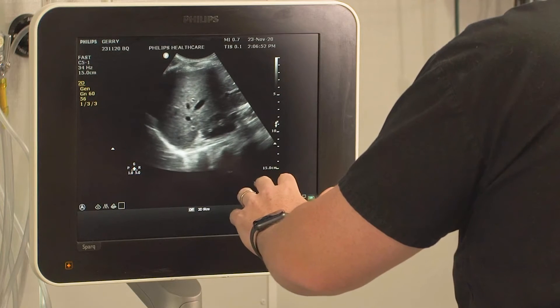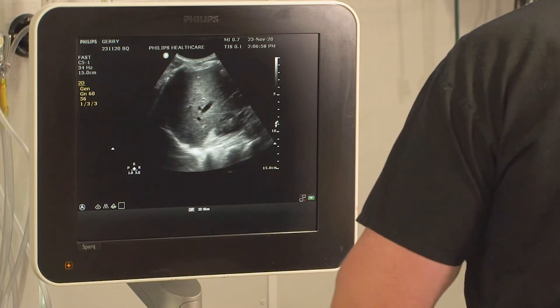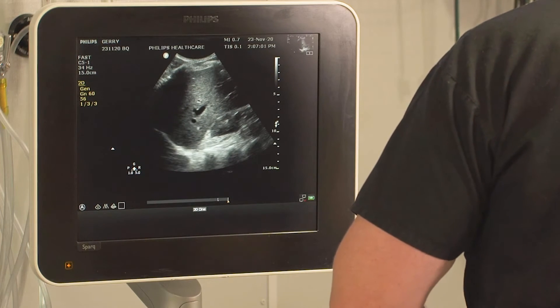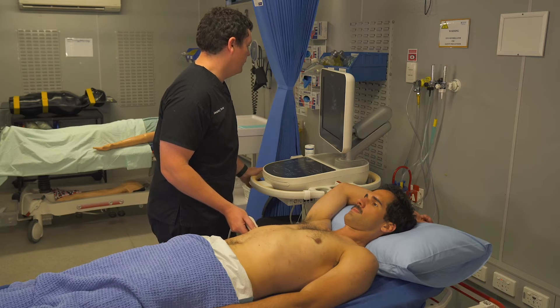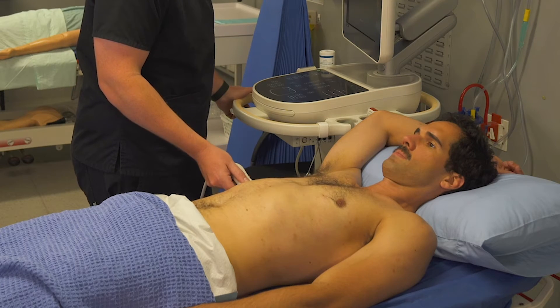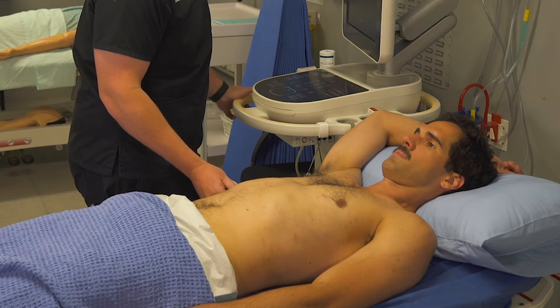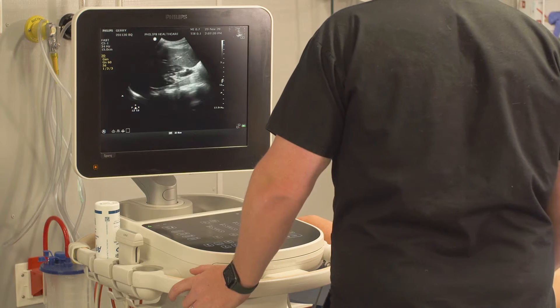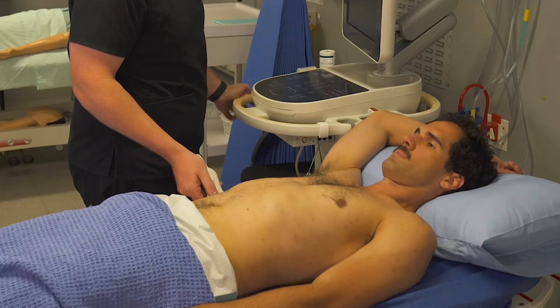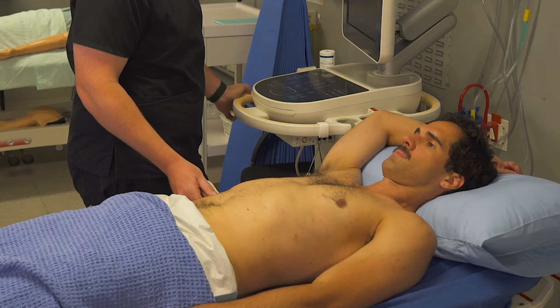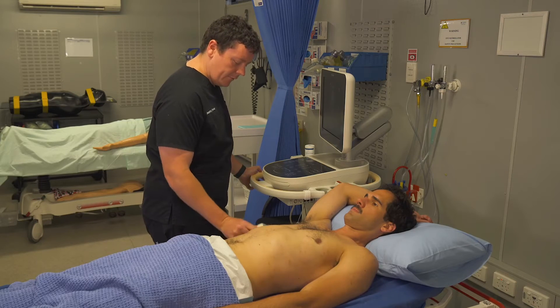We can see diaphragm, spine, and a bit of kidney. In terms of saving the image — there's no free fluid sitting there, so freeze and acquire. Remember that eFAST is a dynamic scan, so from here just slide down and fan all the way through that kidney, making sure you're not missing anything small. Then drop down a rib space, slide across until you can see the tip of the liver, and fan through that liver tip to avoid missing any small amount of free fluid.